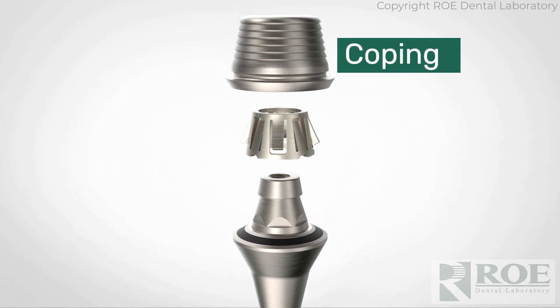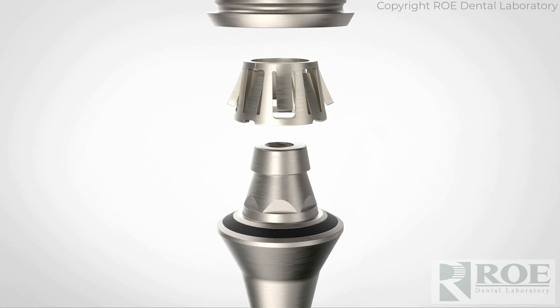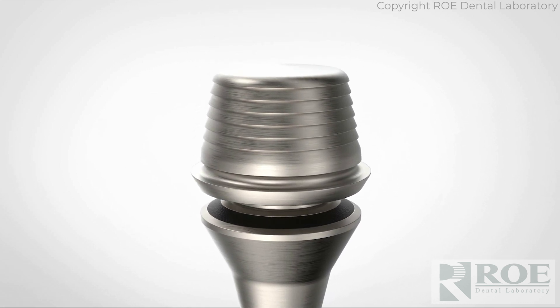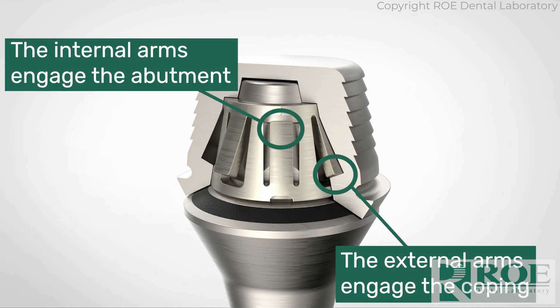It's composed of three parts: a coping, a smile lock, and an abutment. The smile lock is made of a unique memory alloy called nitinol. Each smile lock has eight arms — four interior and four exterior arms. When they're locked into position, they make a secure connection between the coping and the abutment.